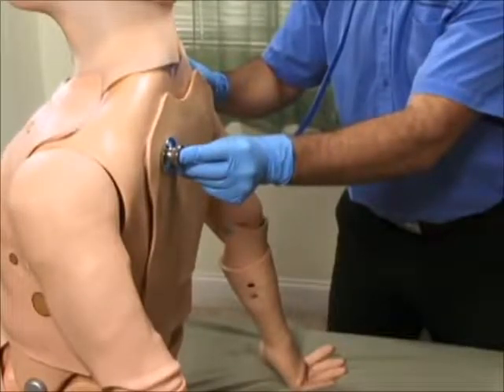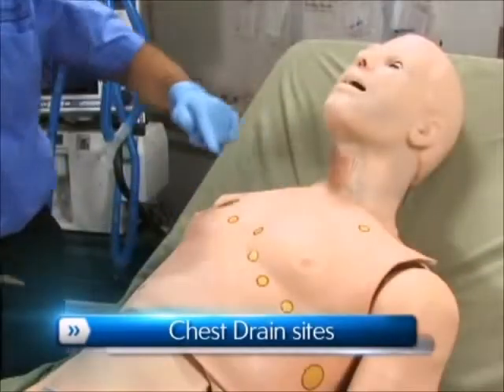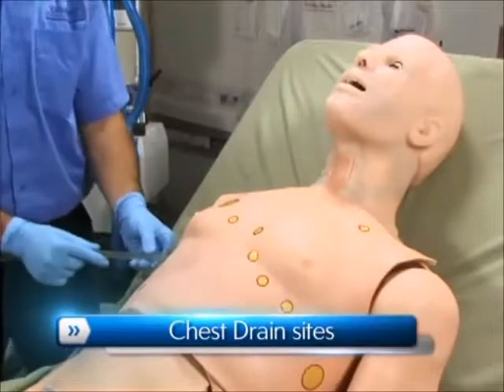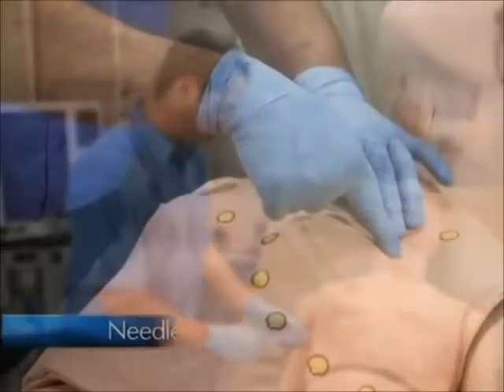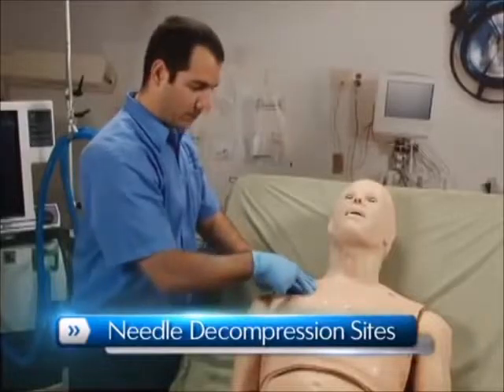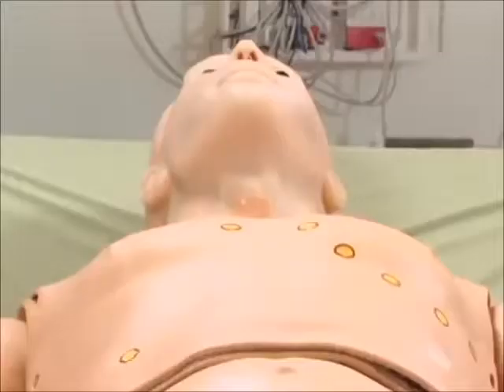Multiple sounds are available. HAL features bilateral chest drain sites at the 5th intercostal space to simulate therapy for pneumothorax or hemothorax. Alternatively, one could utilize the needle decompression site to relieve a pneumothorax. Either lung can be disabled at any time to simulate a collapsed lung.